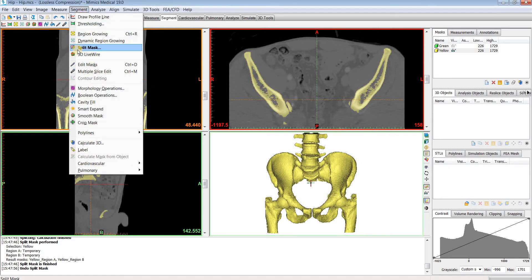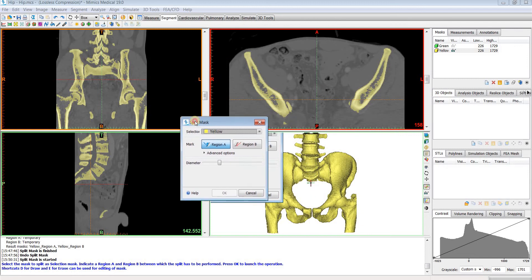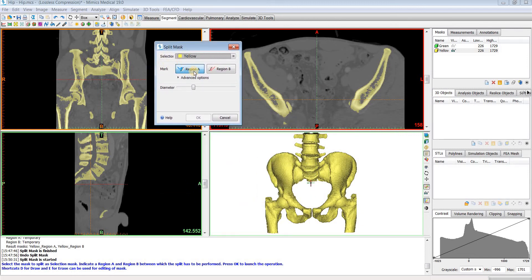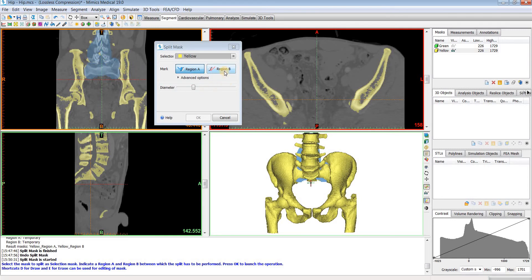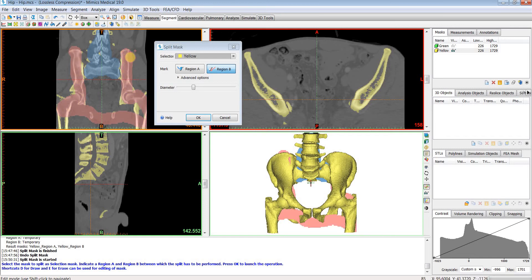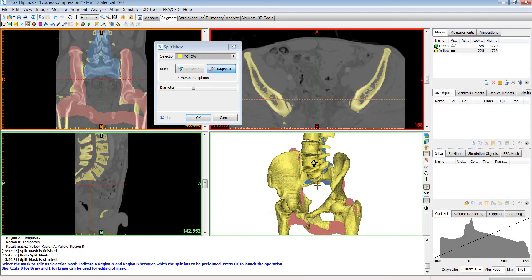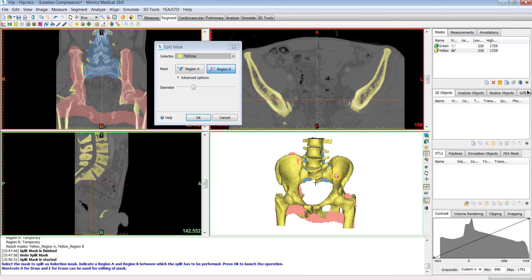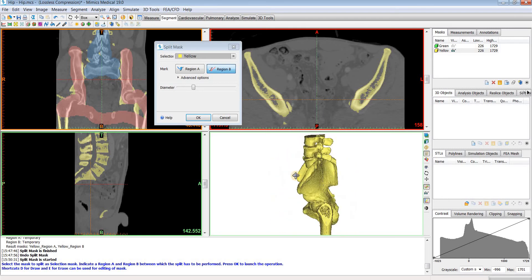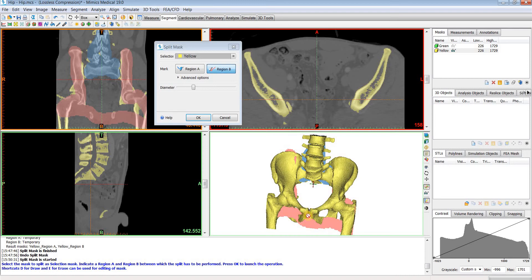I'm going to go to the segment menu and open up the split mask tool. This tool works by marking the region that you want to split off in region A and everything else in region B. So let's say we want to split off the sacrum from the rest of the pelvis — I'll mark that in region A. You don't have to be exact or get every single portion of it. Then I'll mark the pelvis and the femurs in region B. Typically you only have to do maybe a couple slices depending on your images and what you're trying to split off. It basically uses your markings as well as the image intensity gradients to try to find the boundary between the two structures and separate them. You can see a preview of your markings here in the 3D window.